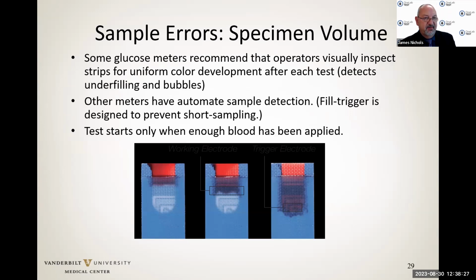Volumes we have to be concerned about. Some devices require a calibrated amount of sample to be pipetted. Others, if you don't get an adequate amount of sample in there, you could get a false negative. Some glucose meters, for instance, will automatically trigger and start the test timing once they sense that enough volume has been added. The question really becomes, if you don't add enough at the beginning, do you have time to go back and re-finger stick that patient, or do you have to start all over again?